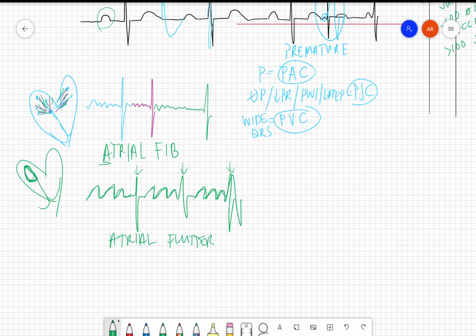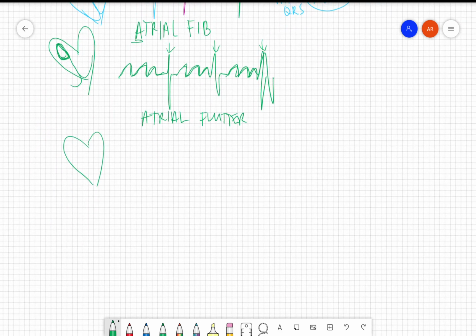Okay, atrial flutter. Now, what happens if we have maybe nothing coming from up here at all? So instead, let's draw this down here. Instead, I have nothing coming from the top, and I've just got this heart that's trying to send all these signals out at once, trying to get anything stimulated to go. What you'll see is this. There's no QRSs because it's completely irregular. It's not working well. This is what we would call ventricular... ventricular what? Fib. V-fib. You're doing compressions on this patient.